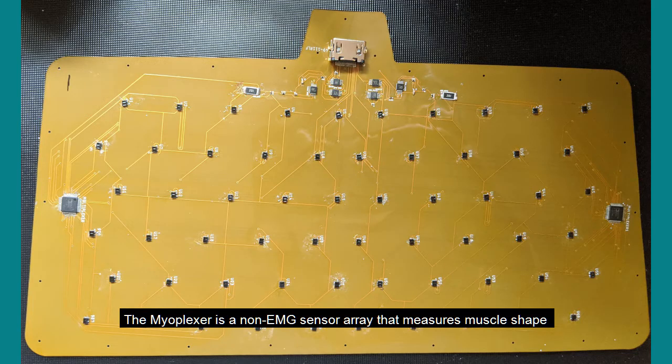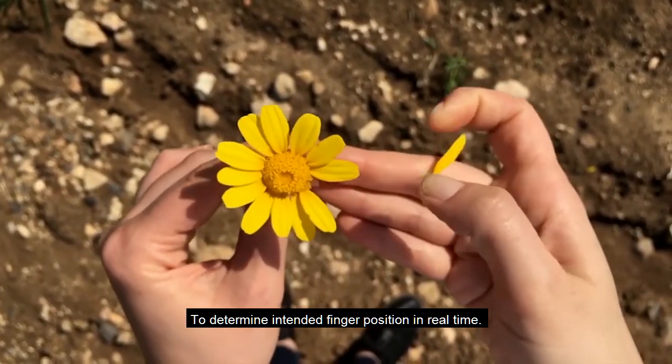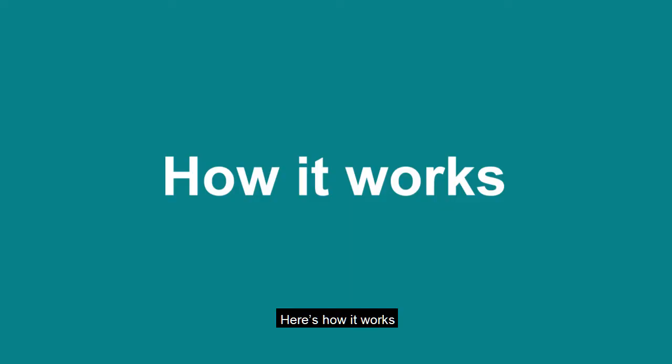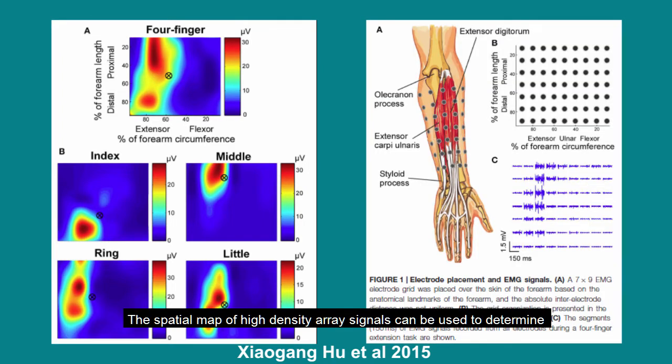The myoplexor is a non-EMG sensor array that measures muscle shape to determine intended finger position in real time. Finger muscle bellies have unique spatial positions on the forearm where their activity can be measured individually with minimal crosstalk. The spatial map of high-density array signals can be used to determine these indicative spatial positions for every finger from a gesture calibration. This is known as spatial pattern recognition.